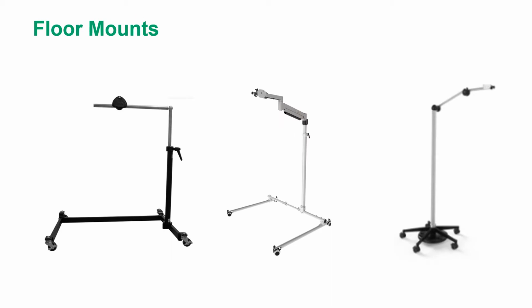Next, we have floor mounts. The base of the floor mount rests on the floor. There are different types of floor mounts. They can either be stationary or they can be more portable with wheels. In many cases, rolling floor mounts are preferred due to the flexibility of moving to where it is needed. Floor mounts can have wide or adjustable bases to fit around recliners or wheelchairs. They have overhanging arms to position the AAC device properly.